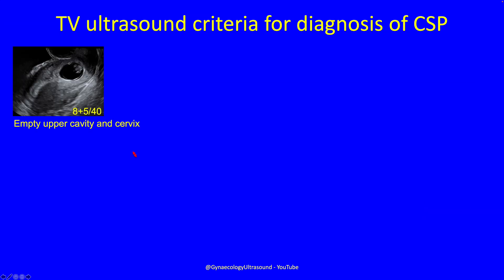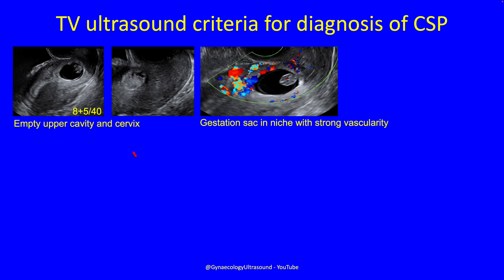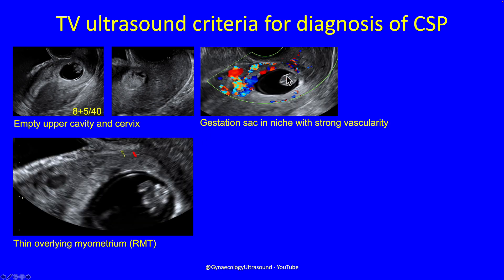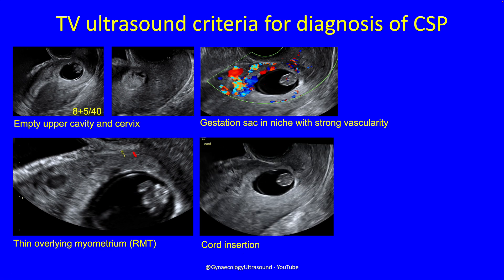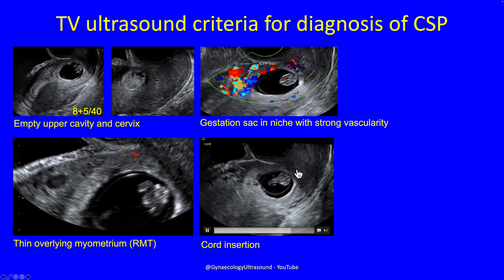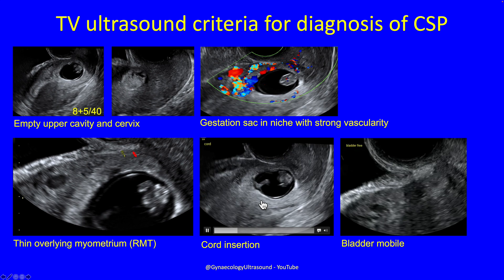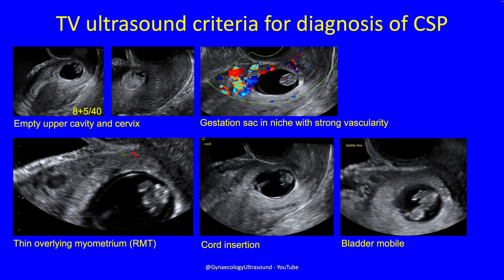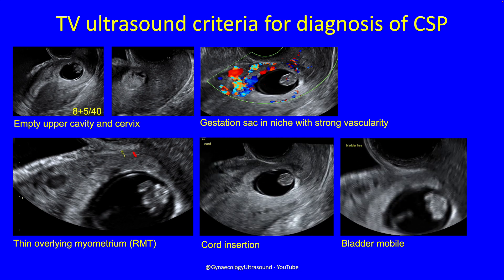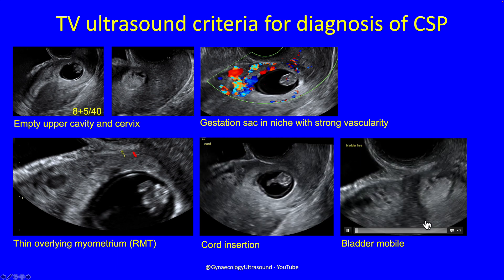Showing an example: we can see an upper endometrial cavity which is empty, and the cervix is empty. This patient was eight and a half weeks gestation. You can see the cervix is empty and there is strong vascularity with very thin overlying residual myometrial thickness. You can also look for the cord insertion — even at this gestation you can see the cord and where it's pointing, which shows the trophoblast. It's also useful to assess whether the bladder is mobile; looking from side to side and pressing slightly, you can see the bladder is relatively free and not being invaded by trophoblast.